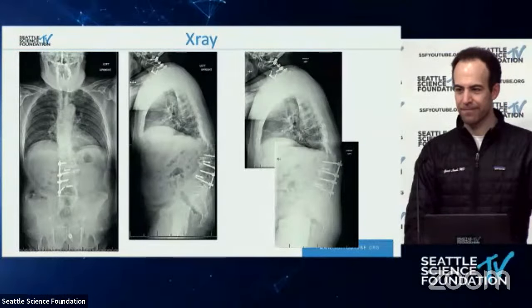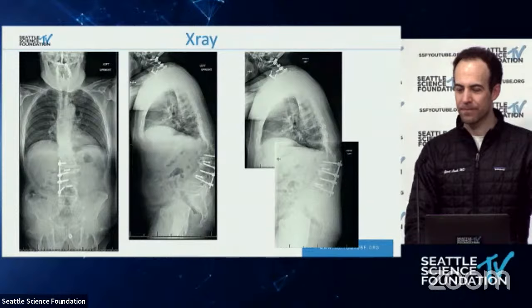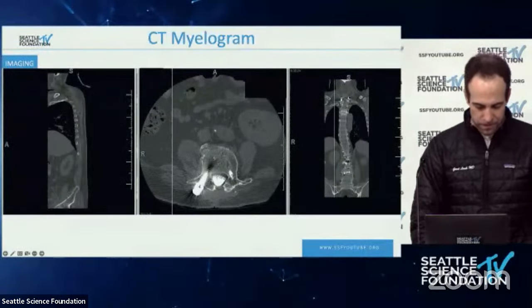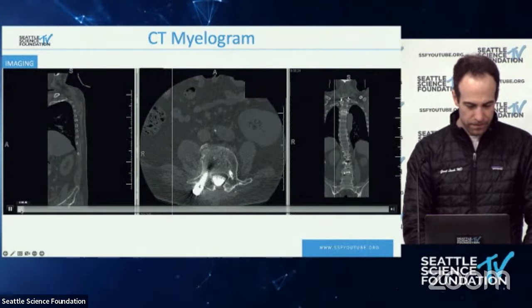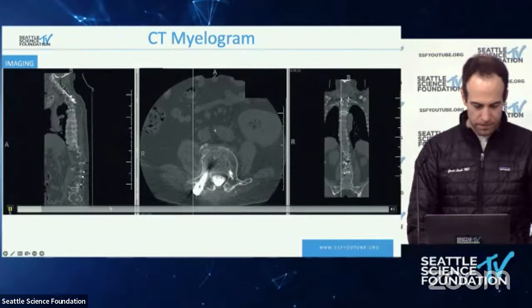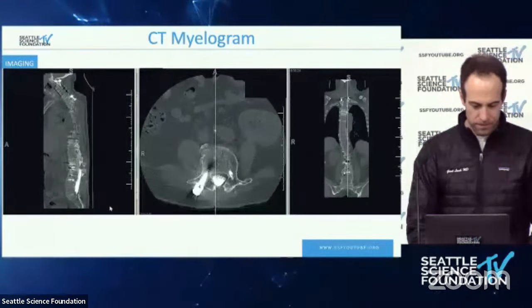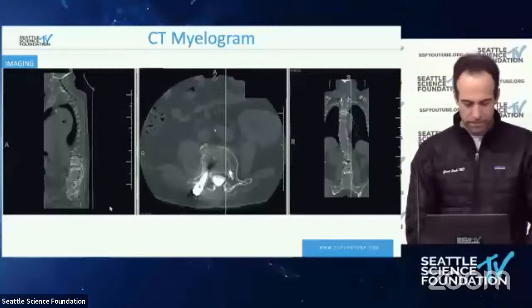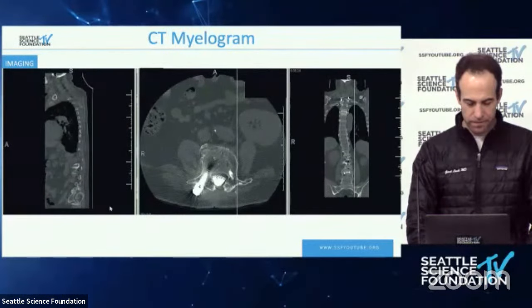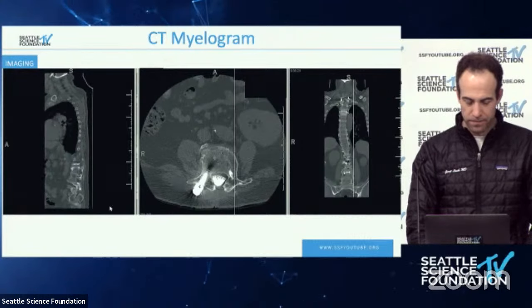That's a good question. We had that as a discussion point because again, there's radiolucency. If you go to the CT sagittal one more time, Garrett, as a nice composite of the left image, he had substantial radiolucency around his upper hardware. And again, I'm with Izzy Lieberman. I'm very leery that there's at least opportunistic infection when we see this kind of a pronounced radiolucency. Maybe a little bit paranoid, but Izzy quotes like literally a third.